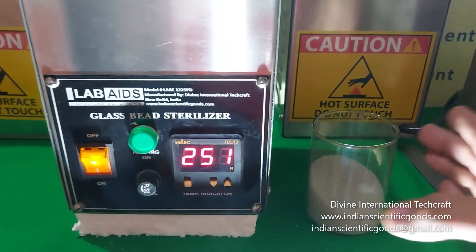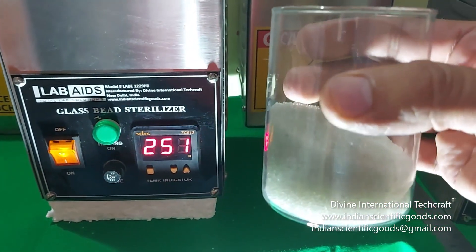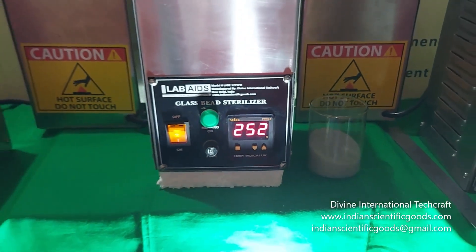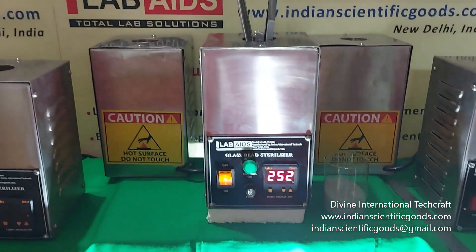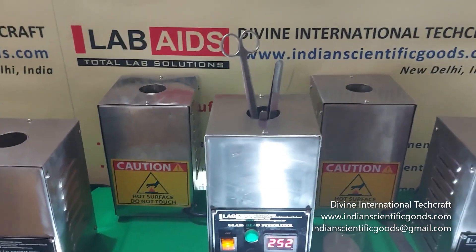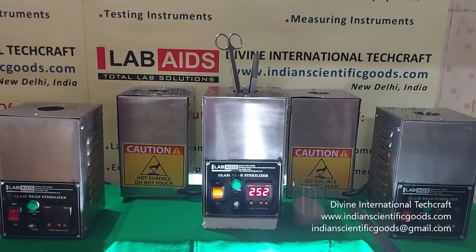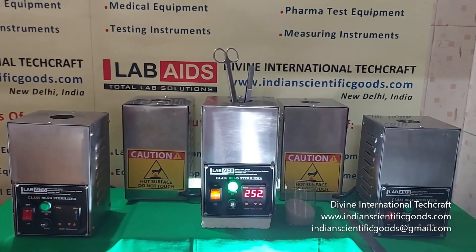Ideal diameter of the glass beads to be used is 1 mm to 2 mm. By using dry heat, these sterilizers eliminate the use of alcohol, chemicals or fire. Sterilization is achieved within 2 to 14 seconds.